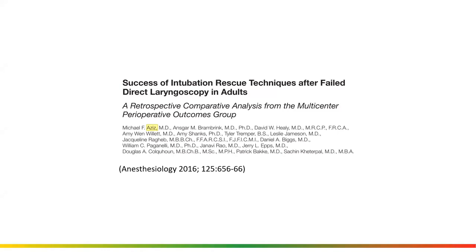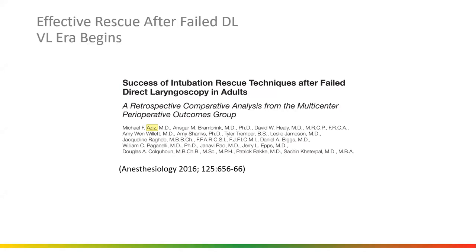Successful intubation rescue techniques after failed direct laryngoscopy in adults. This was a paper published in 2016. Mike Aziz is at the University of Oregon, and that's my alma mater, so that's why I mentioned that. It's a retrospective, multi-center study looking at a lot of rescues. And this really kicked off the VL era, or solidified that a VL is a great rescue tool.